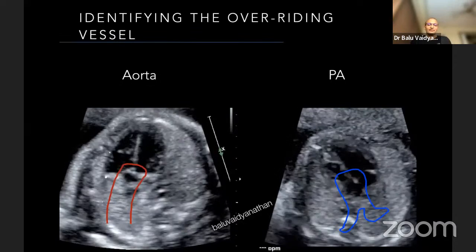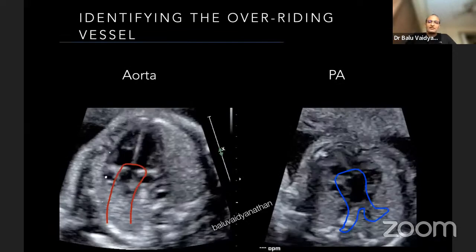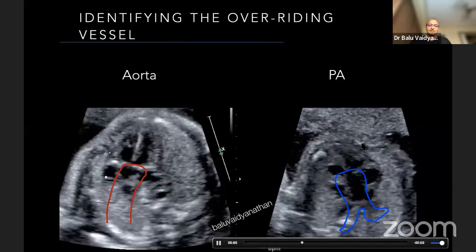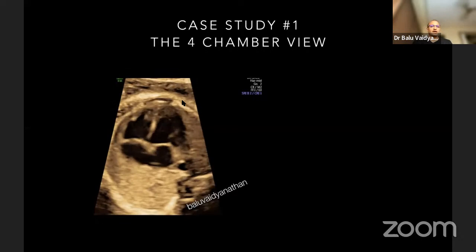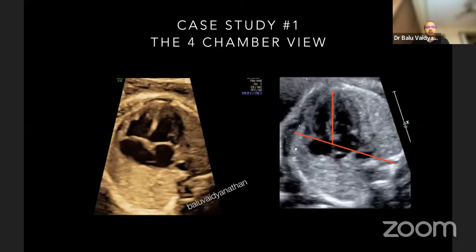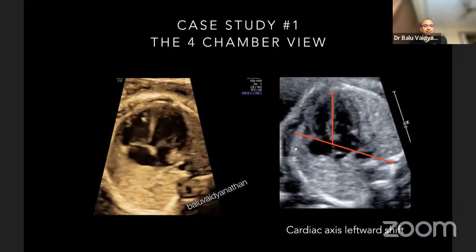If you look carefully at the second picture, you see that there is even ventricular inversion — the left ventricle seems to be on the right side here, so we'll come to that a little later. It is important to identify the overriding vessel. The most common lesion: you have a normal-looking four chamber view, but when you look at the cardiac axis, you find there is a leftward shift of the cardiac axis, even though the first glance of the four chamber view looked normal.